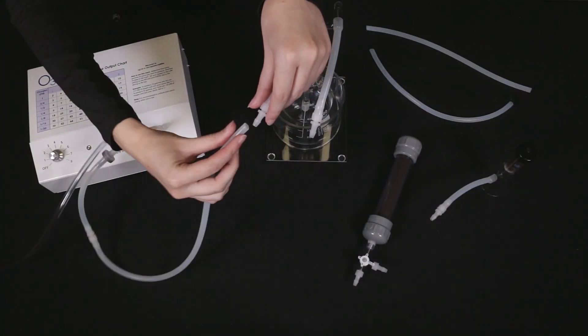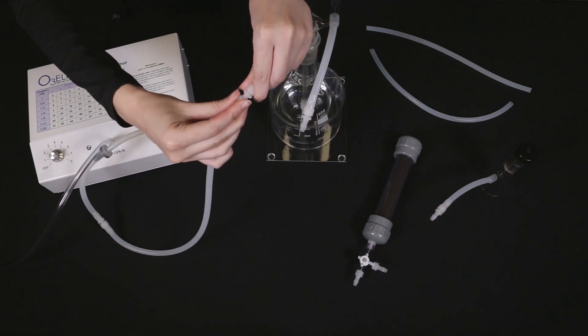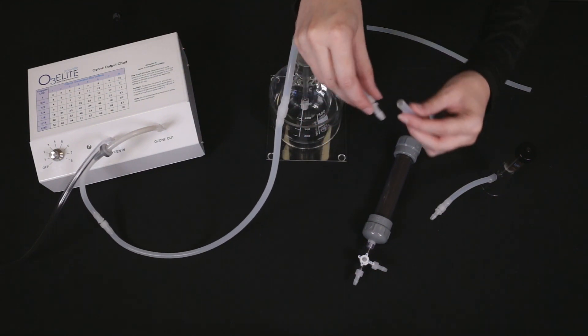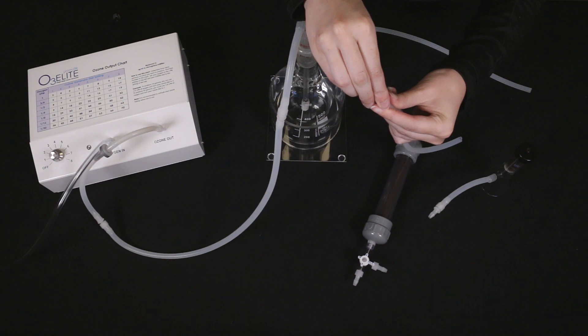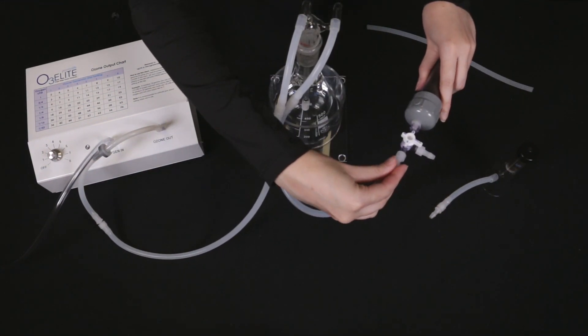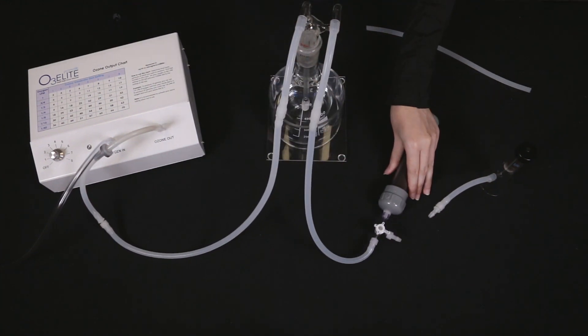Now, connect the other end of the 5 feet of silicone tubing to the glass straw that goes all the way into the humidifier, which we also call the ozone-in straw. Then connect the 3 feet of silicone tubing to the other straw of the humidifier called the ozone-out straw, and the other end of the tubing to the bottom of the ozone destruct system.